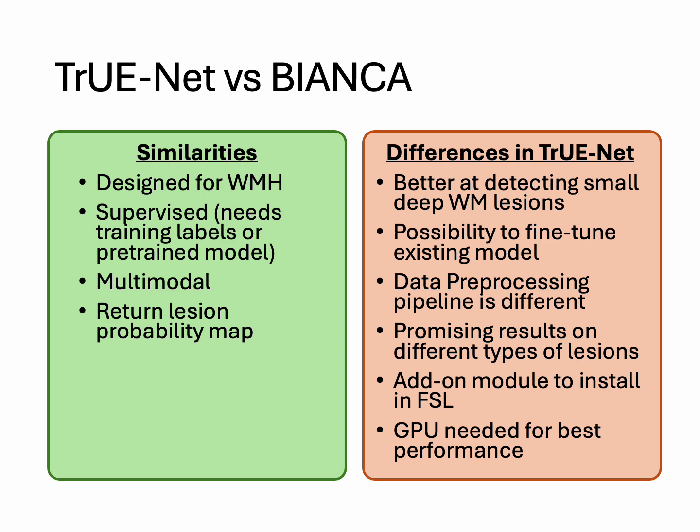Now coming to the differences, TrUE-Net has shown promising results by providing better performance when compared to Bianca, especially in determining the deep lesions which are farther from ventricles. We will see more about it in the actual methodology. And there is a possibility to fine-tune the existing model, which means that you do not have to train the model from scratch when you have a very similar data set. You can take a pre-trained model and fine-tune a few layers from the existing model, and just tweak the model a bit to match the characteristics of the new data set.